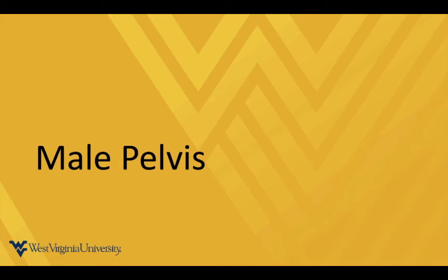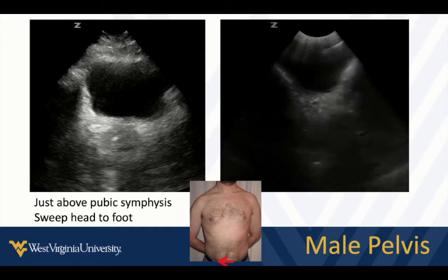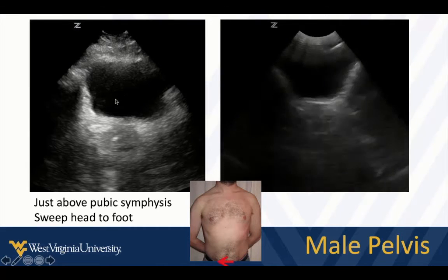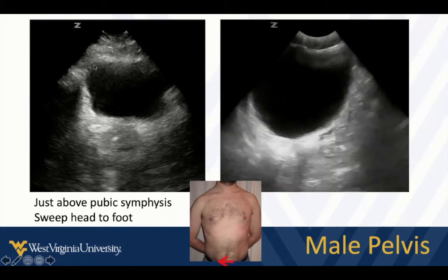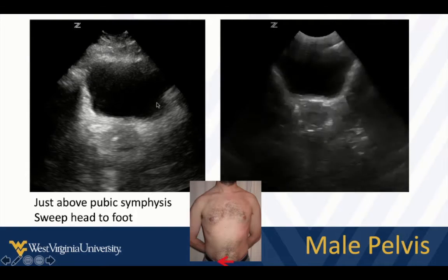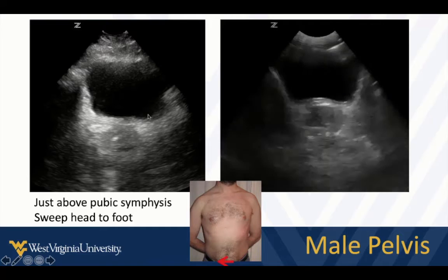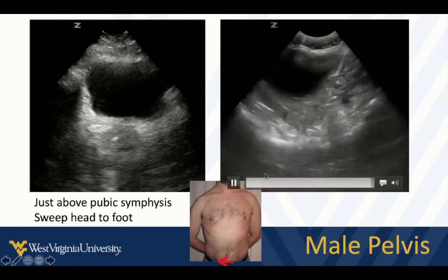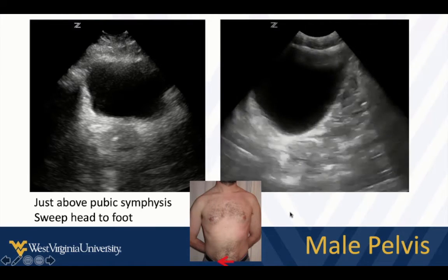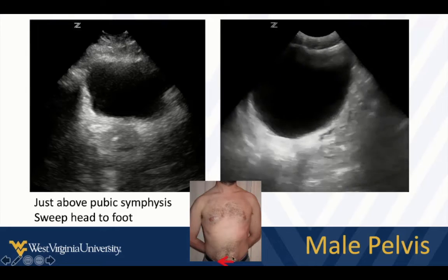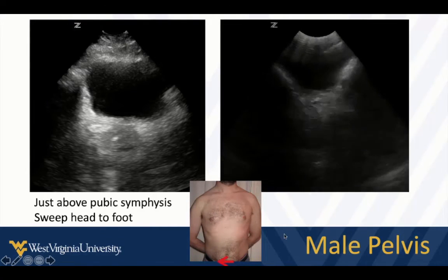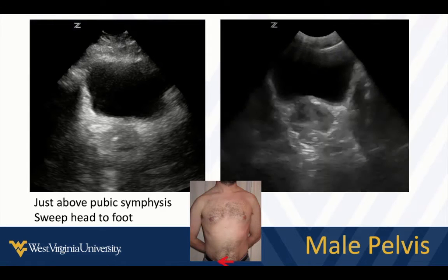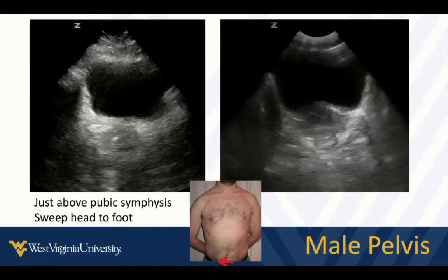The last place we're going to look for free fluid is in the pelvis, which looks a little different from male to female. In the male pelvis, the bladder is going to be small or large depending on how full it is, but it should be somewhat fluid-filled. We see the prostate back here. These are both transverse views, with the probe right above the pubic symphysis, indicator directed to the patient's right. We fan to their feet and to their head to examine the bladder completely.